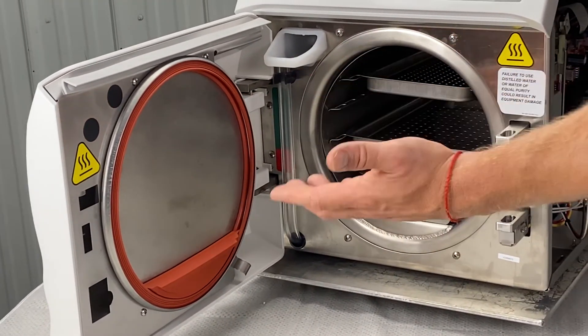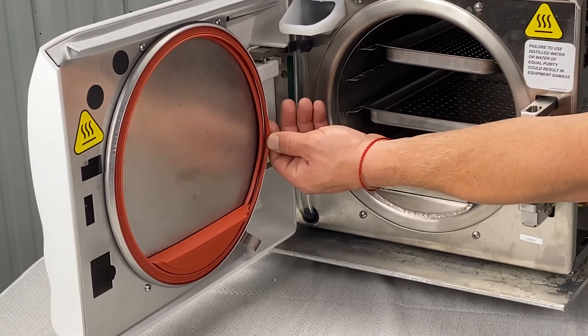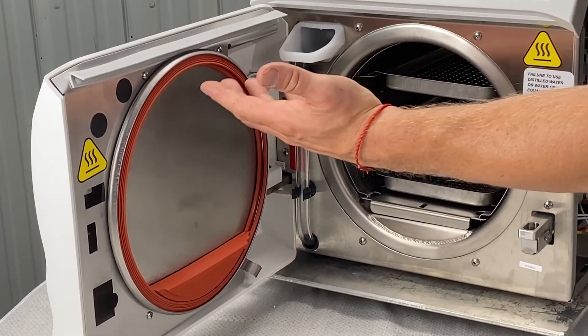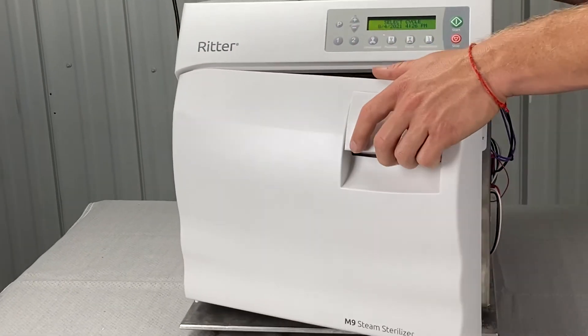If you haven't replaced the dam gasket, it's time to replace it. If you just put a new gasket in and you have a ring with it, take the ring out and run the new gasket to see if it leaks that way — your ring might've been bad. We can help you out with that.